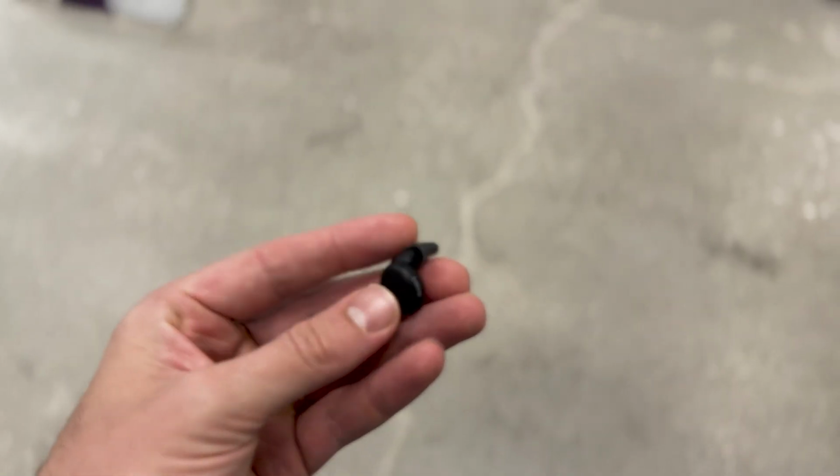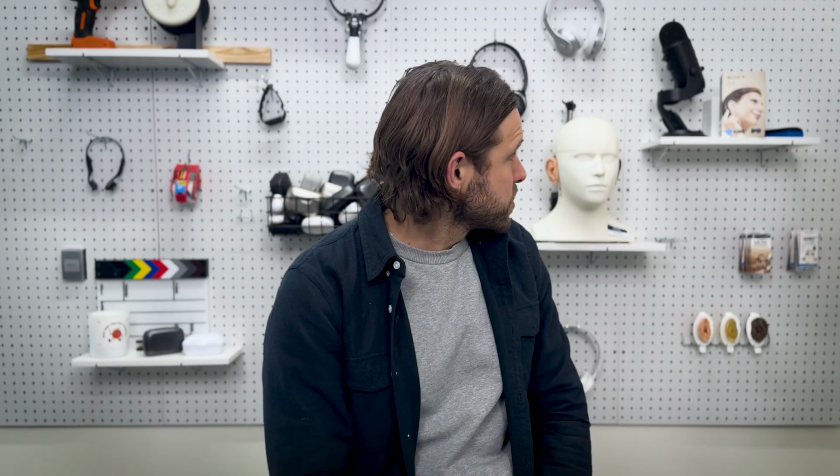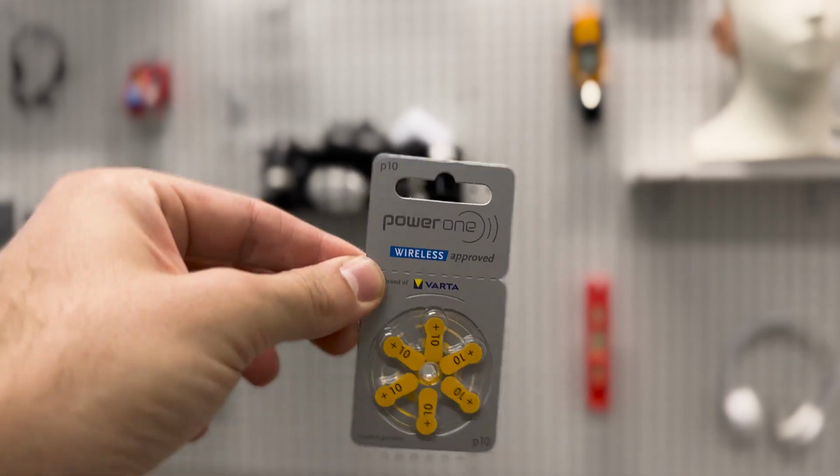All right, so here in the studio, I have all 3 of Sony's over-the-counter hearing aids. There's an earbud style, an invisible, rechargeable style, which is the one that I'm wearing now, and then one with disposable batteries. I'm gonna talk you through each one in depth and talk about which ones we think are the best for which particular cases.